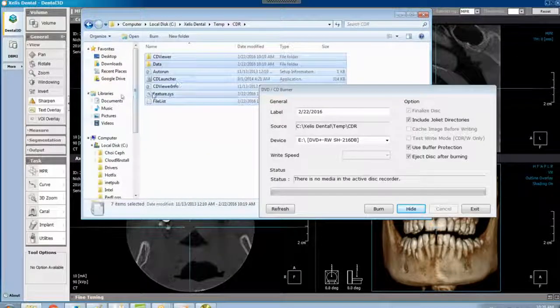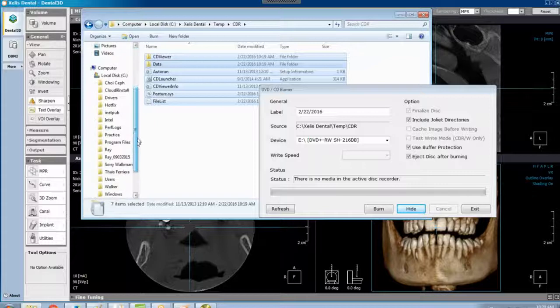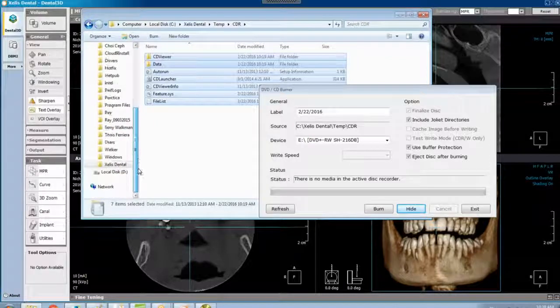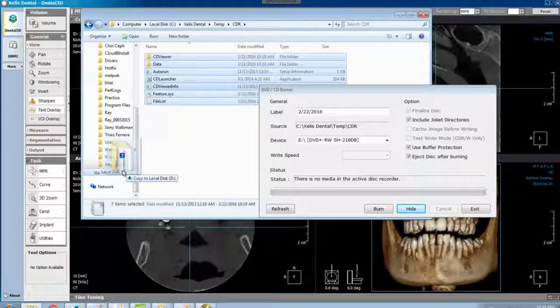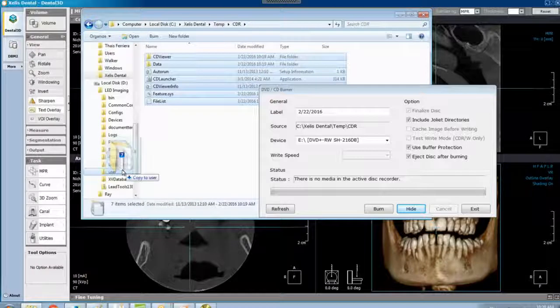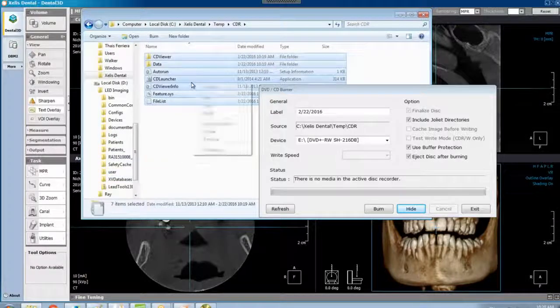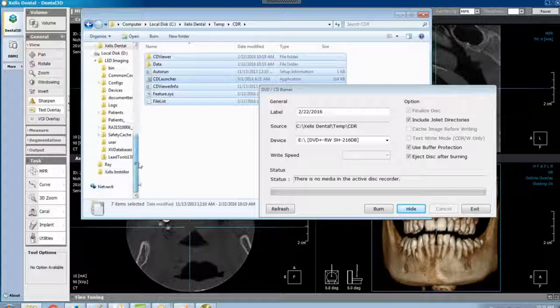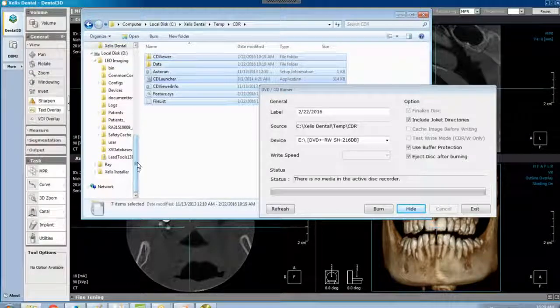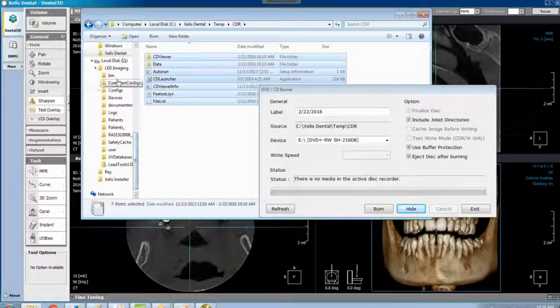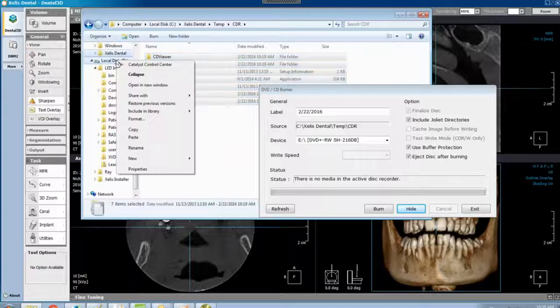Or you can drag and drop them into your USB. Your call. If you right click, copy, find your USB, right click and then paste.